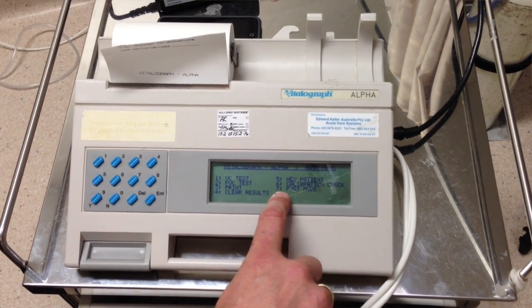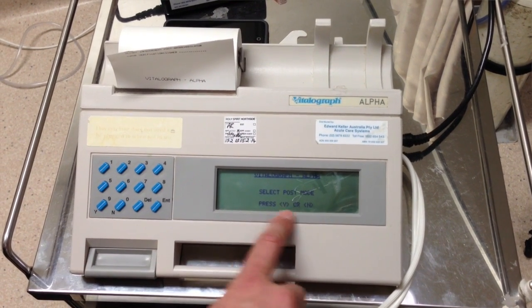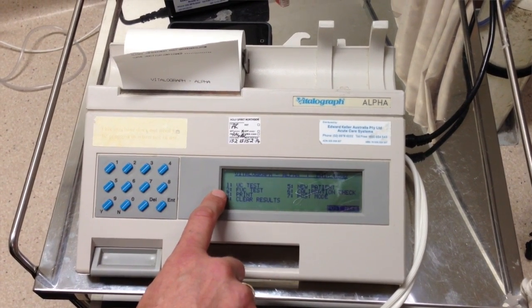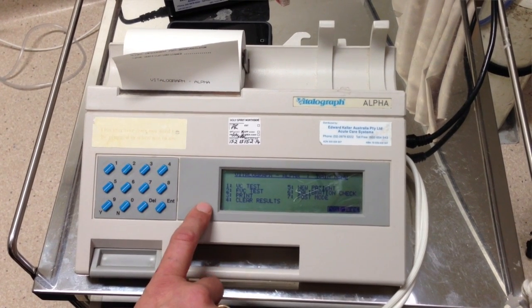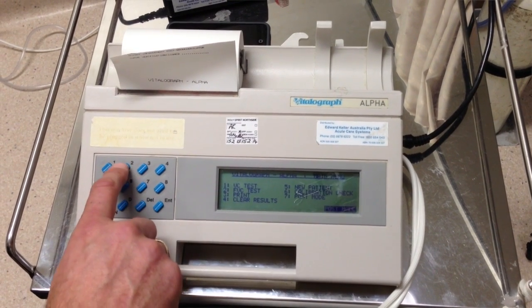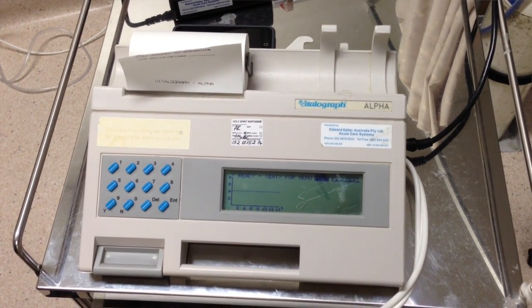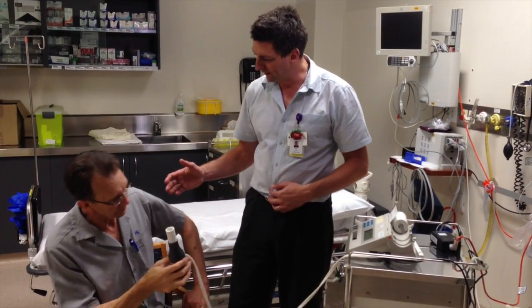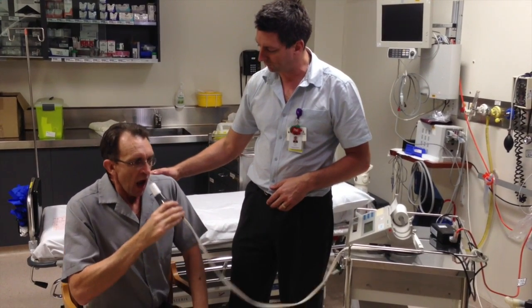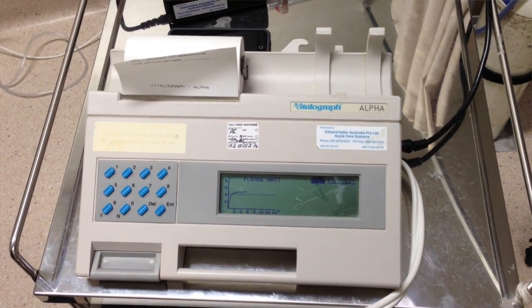The post mode corresponds to number seven, so I'll press seven. Do I want post mode? Yes. It will come up 'post mode' in the corner and then I press number two again for forced vital capacity. When the machine's ready, it'll tell you and then you get the patient to do it again. So Derek, just get you to repeat that — nice big breath in, put your lips around it, blow out as hard and as fast as you can. Blow, blow, blow — keep pushing, go, go. Well done.